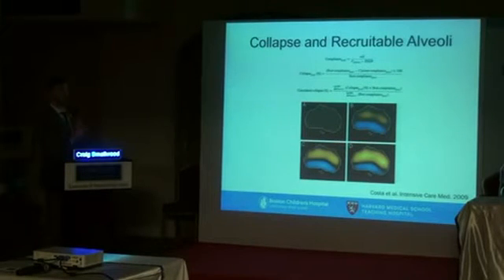they're overdistended and collapsed. So you can see the orange here is Costa et al., their group published this several years ago. They looked at different levels of PEEP, and what they did was to demonstrate that as you escalate, so this is a baseline image, basically no differences, and we get two images. So we have a baseline with conventional ventilation settings with a discrete PEEP value, and then we'll look at areas where we're overdistending, and then this is going to be recruitment. So the orange is basically bad, and the bluer it gets as we step through this series of images, the better we're resolving atelectasis. So you can see here they're performing a recruitment maneuver in this subject, and what they're doing is they have to overdistend.